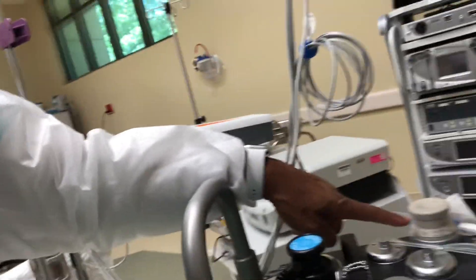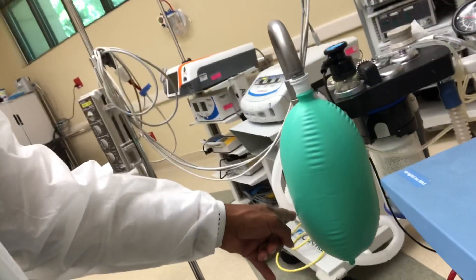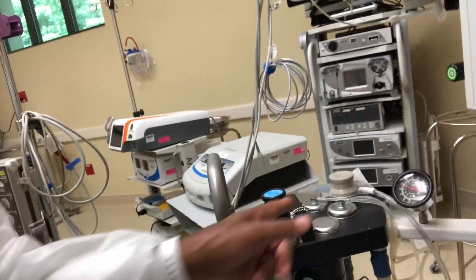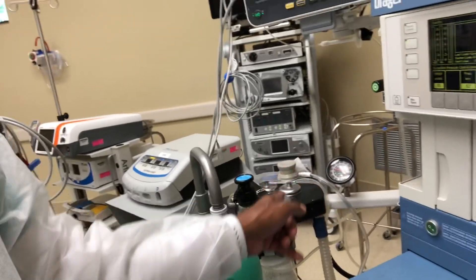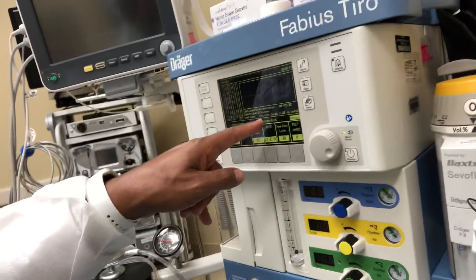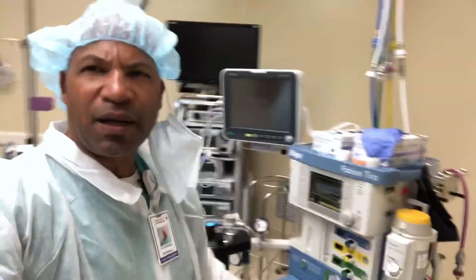We're in manual mode at 40, our bag is inflated, and we're basically looking at the whole circuit to make sure that nothing is leaking — that it is holding tight pressure. Here on the screen we're seeing that it is pressurizing, so this is very important to do to make sure the machine is ready to go.